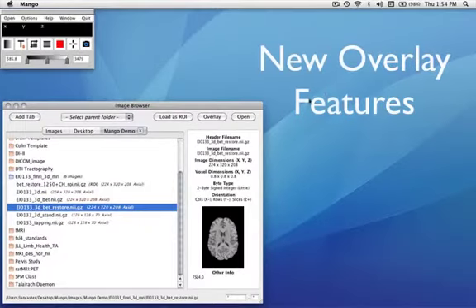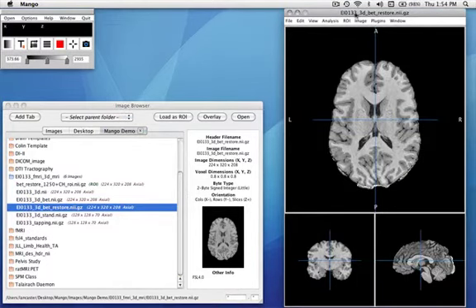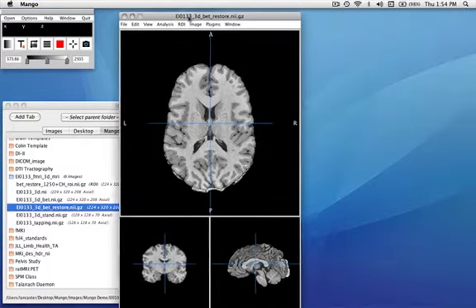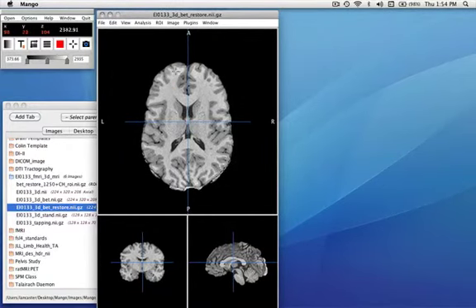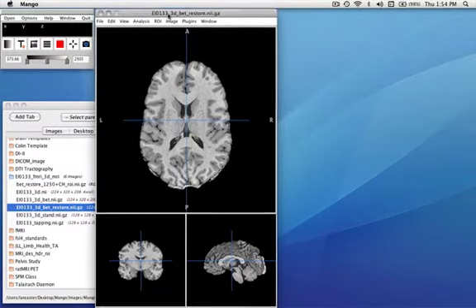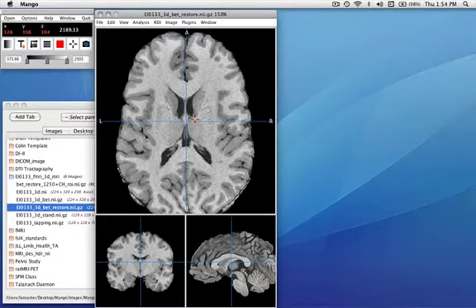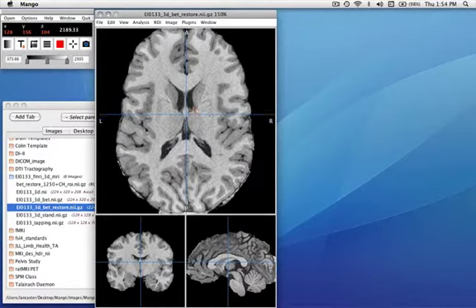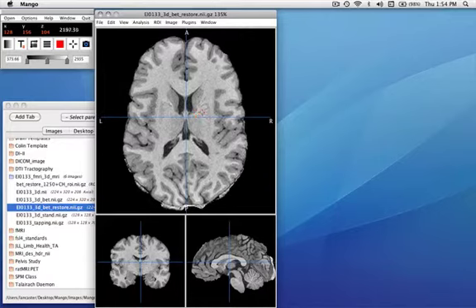This is a demo of Mango's new overlay features. I'm going to start by loading a high-resolution MR image. This image has .8mm spacing in all three directions. I can now zoom up using scroll, and we can also pan around within this window. Zoom it down to the right size.